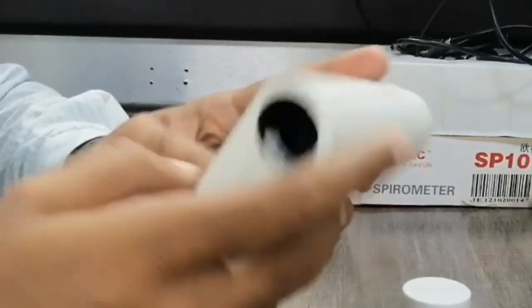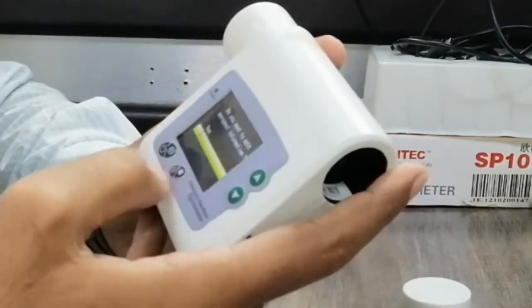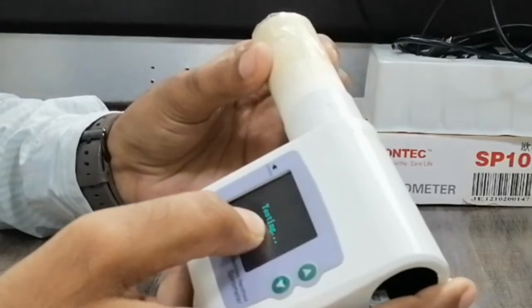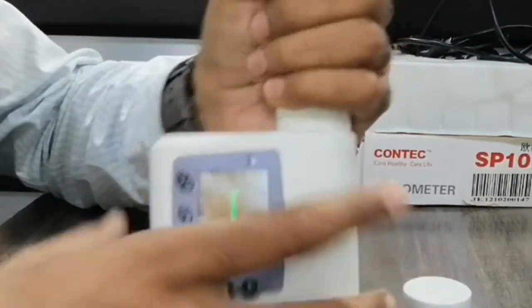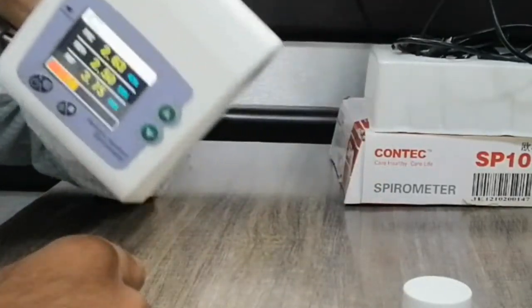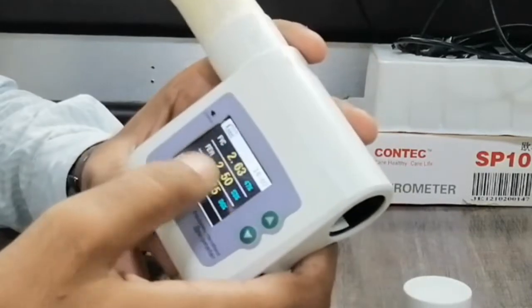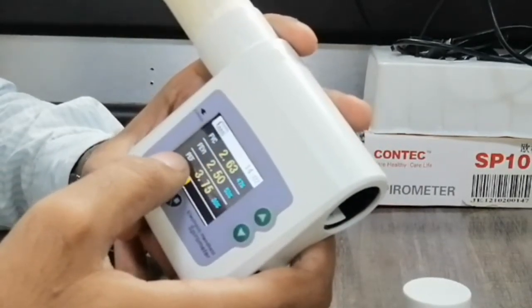The machine shows a message: do you want to edit personal information? You can select yes or no. Here is the testing mode — we can use the mouthpiece for the patient. I plug it in and press air through the mouthpiece. Be careful to use a single mouthpiece per patient. The reading shows FVC, FEV1, PEF and other parameters.